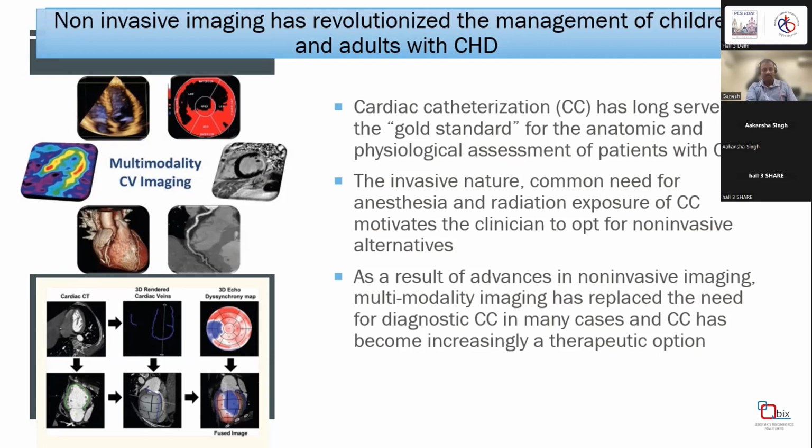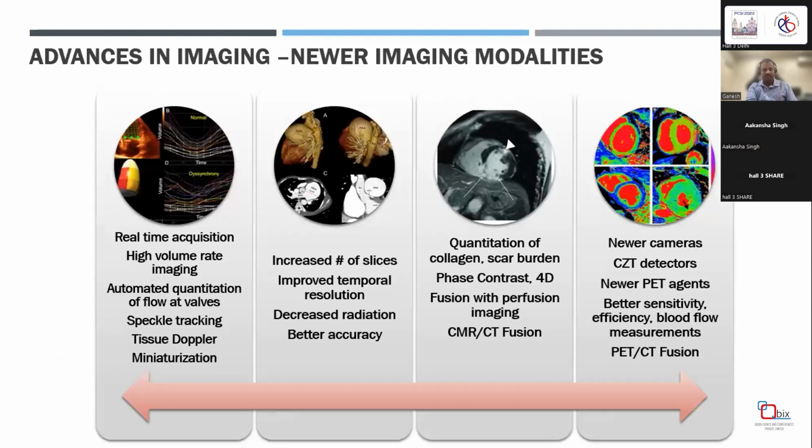Now, because it is invasive in nature, it needs anesthesia and radiation exposure. We are trying to look at other non-invasive modalities as alternatives. And in parallel, we have a lot of advances in non-invasive imaging, which we can call multimodality, or sometimes I may use the term advanced imaging also, has replaced most of the time the diagnostic cath. And so now cardiac cath pretty much has a therapeutic role.